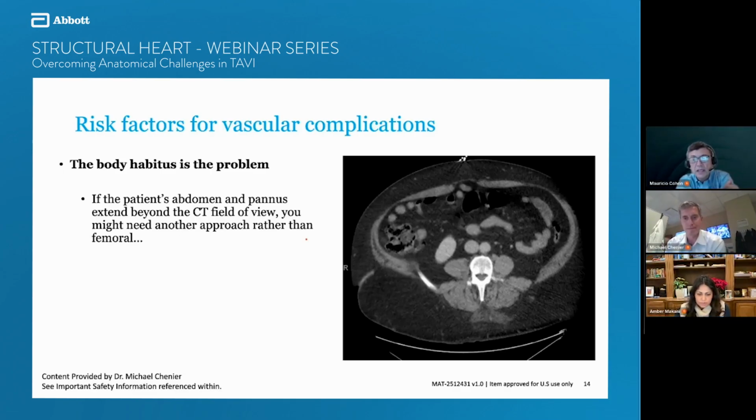So my thoughts are, well, we use ultrasound. For a calcified vessel, you don't want to feel the vessel crack when you advance the needle, because that's ominous. You know that you're not going to be able to deploy the ProGlides to do the post closure. So that's not a good thing.